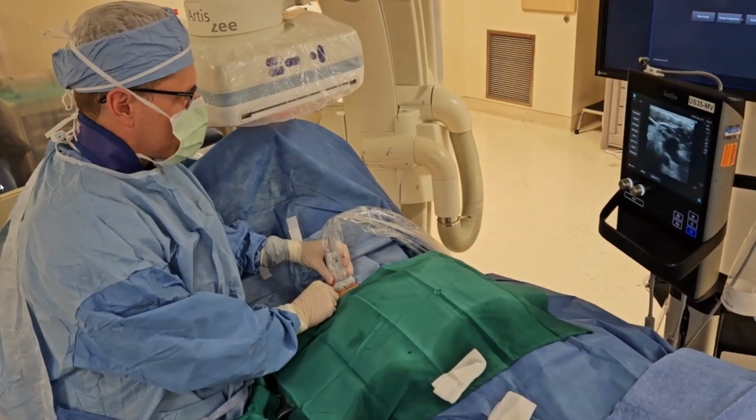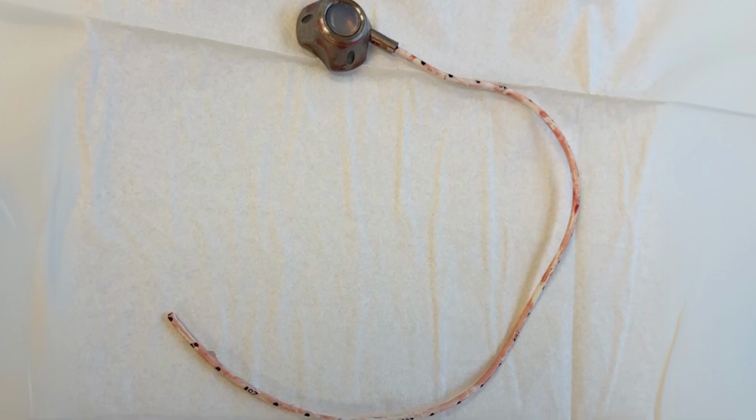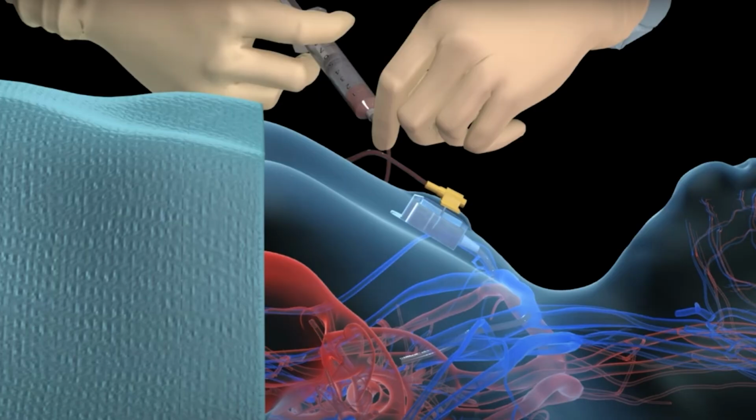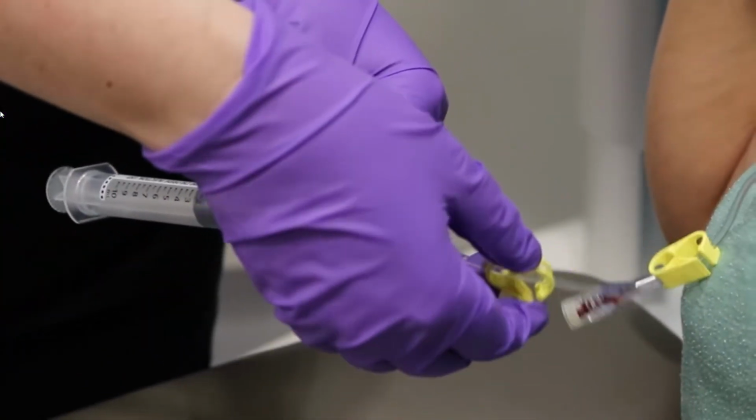So in this video, I'm going to be talking to you about what to expect when you come for your Mediport removal. And this is something that I enjoy doing a lot because, as we know, when we put the Mediports, it's usually because patients have been diagnosed with cancer, which is a very scary moment, and we're seeing them for the first time, and they need this device that goes into the jugular, and they are expecting to get chemotherapy.